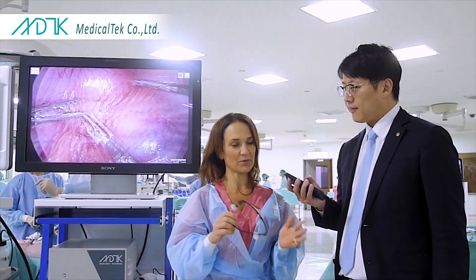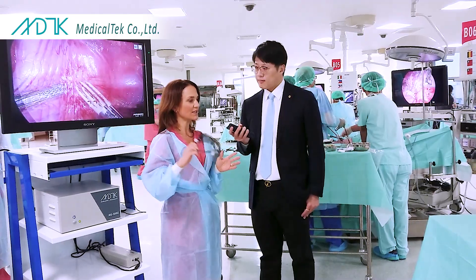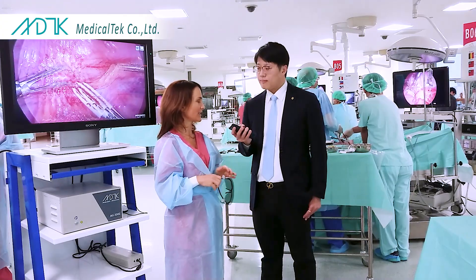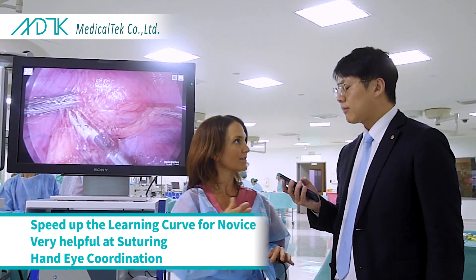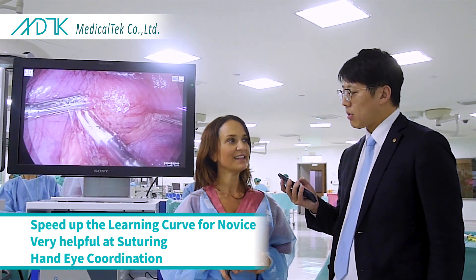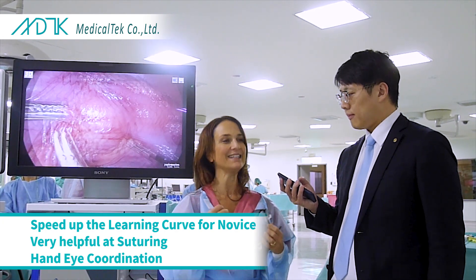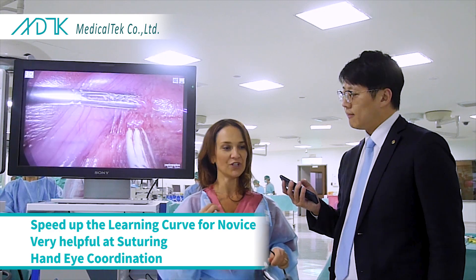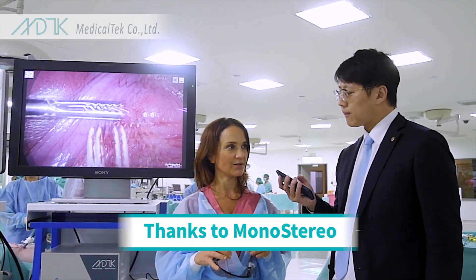Whenever we teach laparoscopic surgery to a novice, the most difficult thing is suturing. I think it could really speed up the learning curve for novices, and I would be open to having my own residents start with the system when they're suturing. I think that it will make them more comfortable because they have an easier hand-eye coordination, thanks to the monostereo.